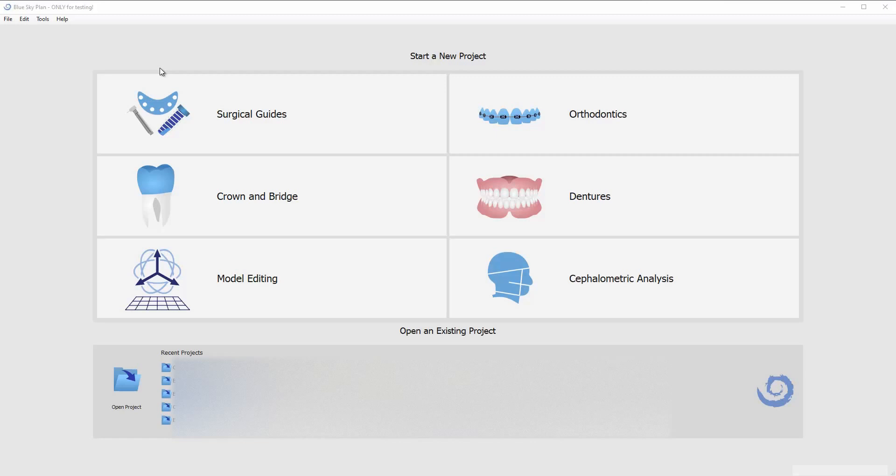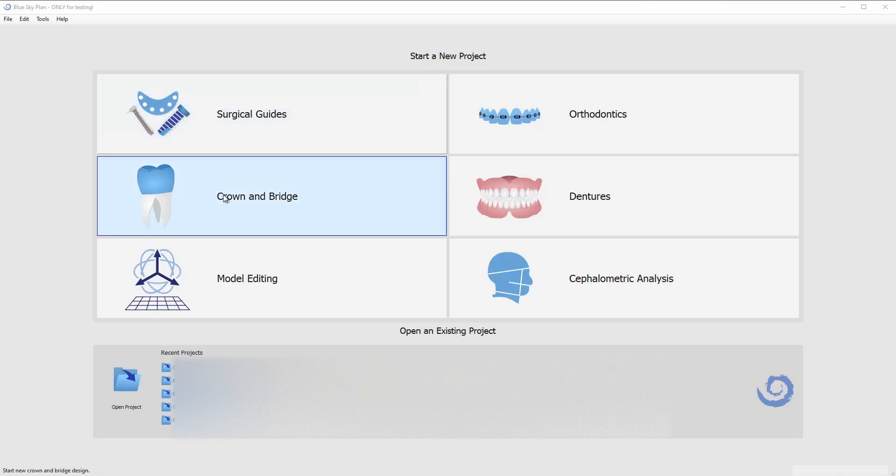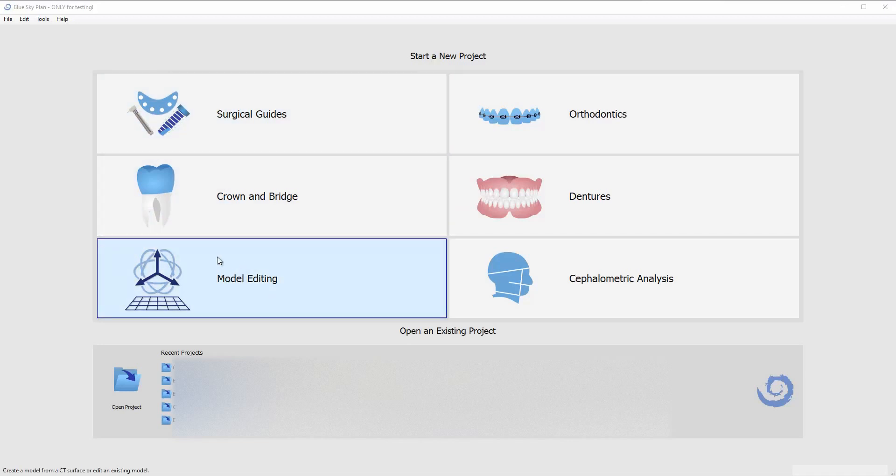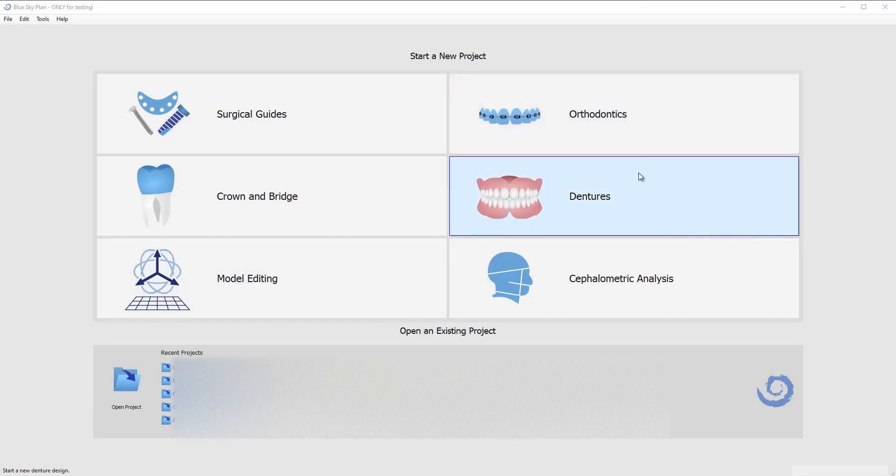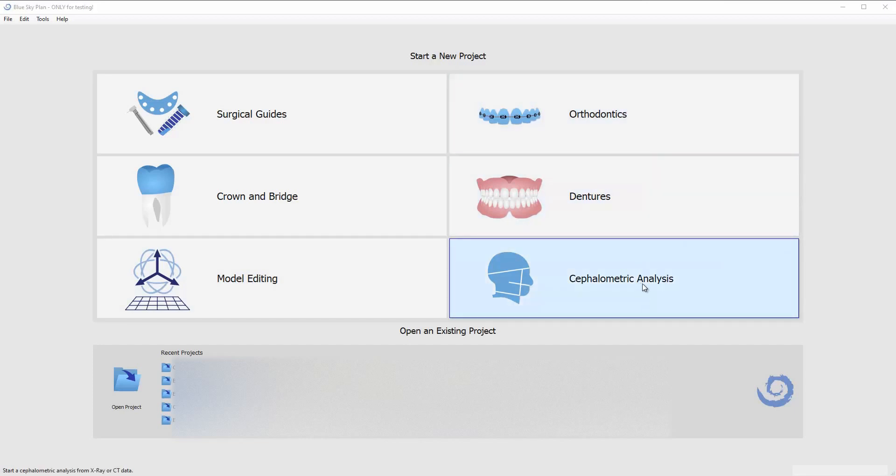So first things first, when you open up Blue Sky Plan this is gonna be the first window that's going to come up and as you see we have different modules for surgical guides, crown and bridge. Model editing is for working on closed models and adding labels and things like that. You can also go to orthodontics where we have the ability to do clear aligners and indirect bonding trays for brackets, dentures, and then cephalometric analysis.